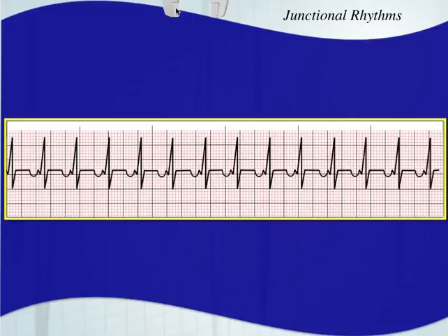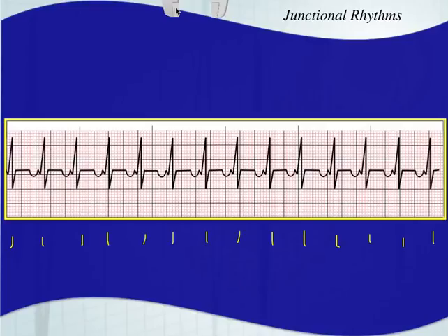This next one is obviously faster — pretty much the same morphology as the one before, except for a much faster rate. Counting 14 complexes gives about 140 beats per minute. So this is junctional tachycardia. You have an inverted P wave, a consistent short PR interval, and a narrow QRS complex. It's a regularly regular rhythm.